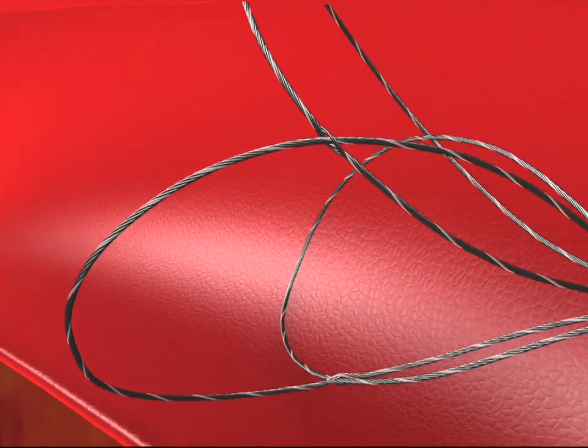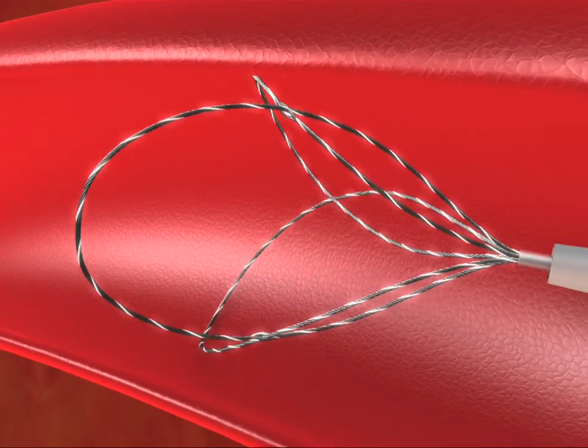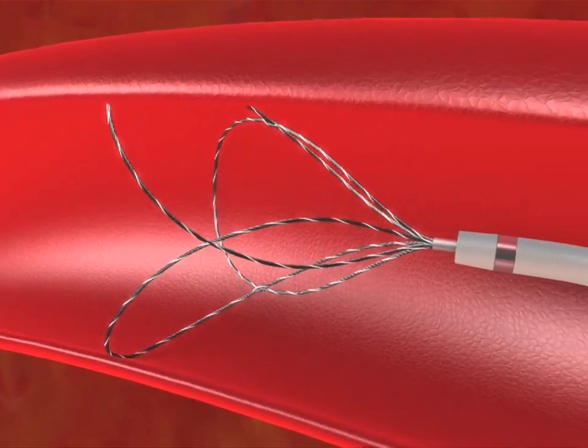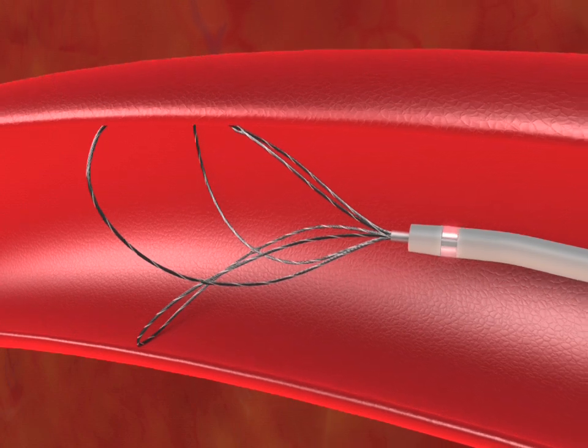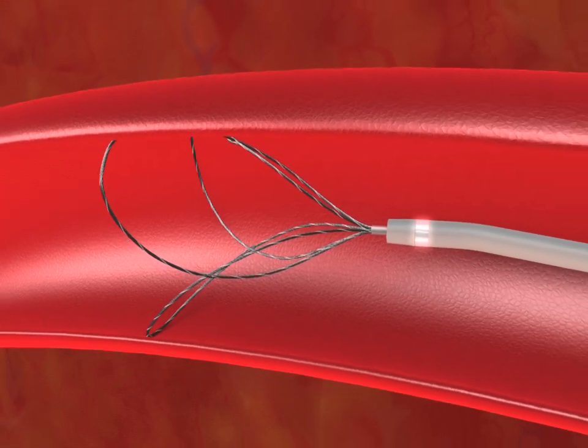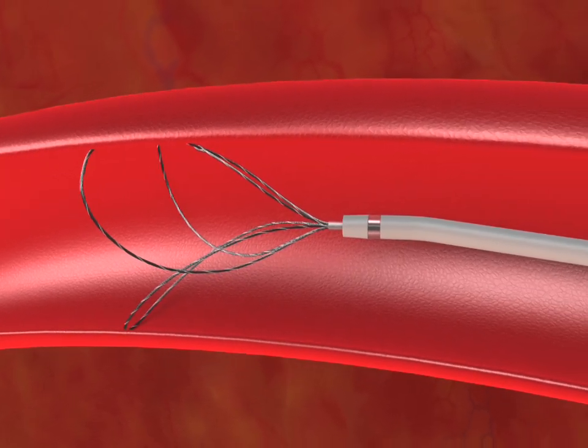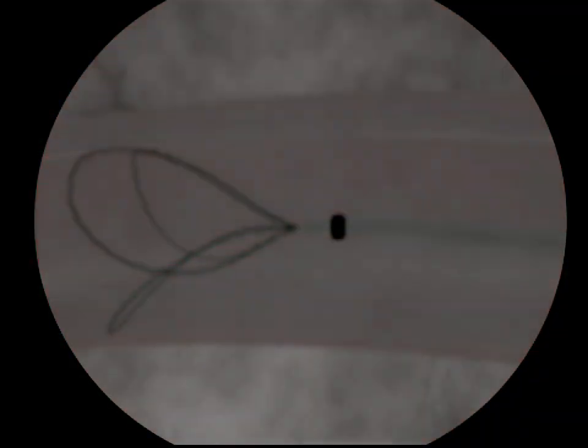Excellent fluoroscopic visualization is provided by platinum strands that are incorporated into the snare loops, and a radiopaque band is also added to the N-Snare kink resistant guiding catheter to ensure easy visibility during fluoroscopy.